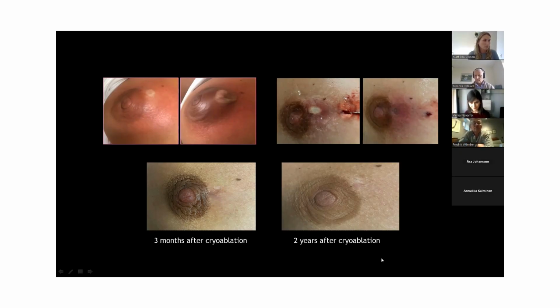And here, 2 years after, with the whole fistula closed and looking this good. So you can imagine how grateful this patient is after 2 years having this nonstop. So the quality of life of this patient is excellent now.